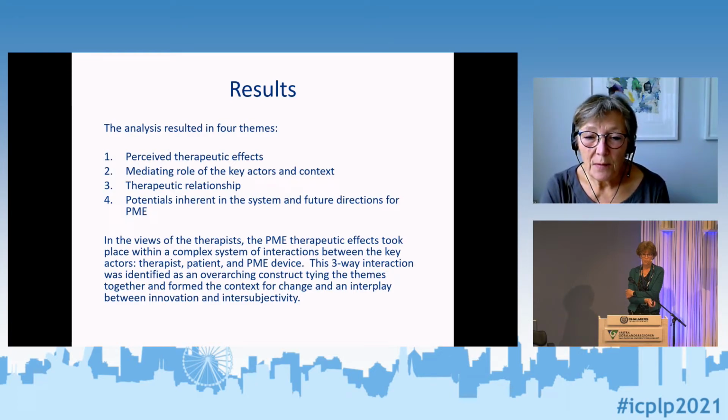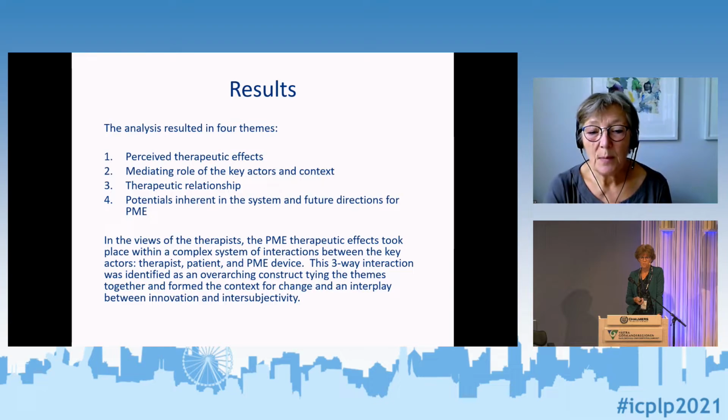So in the views of the therapists, the phantom motor execution therapeutic effects took place within a complex system of interactions between the key actors, the therapist, the patient, and the device. And this 3-way interaction was identified as an overarching construct, tying the themes together and forming the context for change and an interplay between innovation and intersubjectivity.